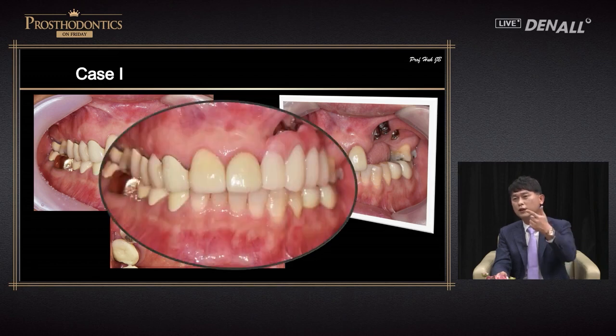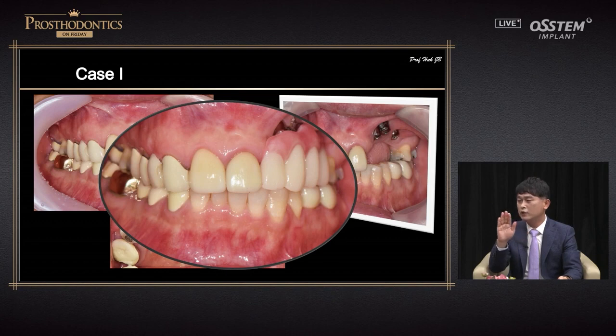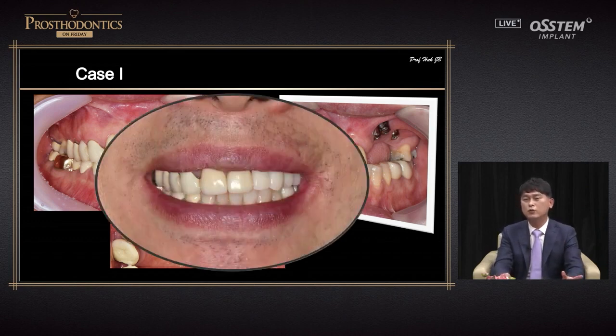It is just like the removable prosthesis. However, we made gingiva and the emergence profile is created. Artificial teeth can be aligned like this. I instructed the patient to clean it using a water pick and take it out once a week. And the patient said when it's taken out, there's some whitish thin film over the gingiva, which is cleaned using a toothbrush, and the patient is satisfied.